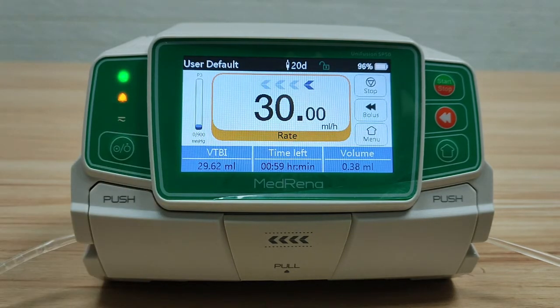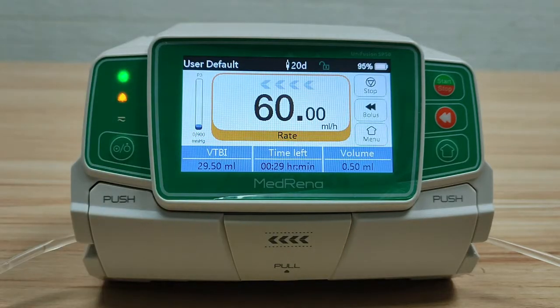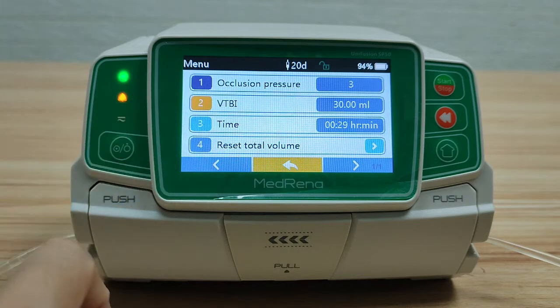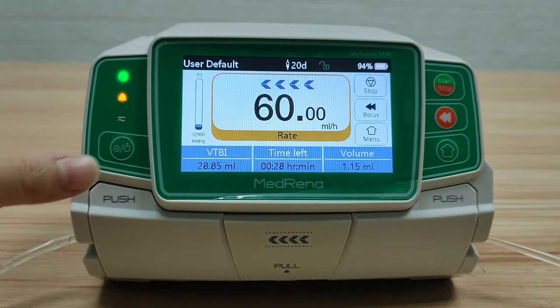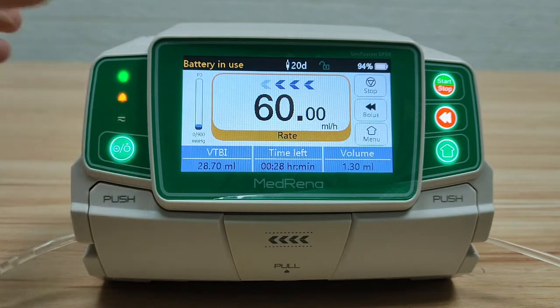The flow rate can be changed anytime as needed without stopping the infusion — simply press the flow rate on the screen and change the number. The time left is recalculated accordingly. Apart from flow rate, other parameters can also be changed without stopping infusion: press Menu to reset occlusion pressure, VTBI, infusion time left, and total volume. During infusion, you can lock the screen by pressing the power key. Press the power key again to unlock the screen.